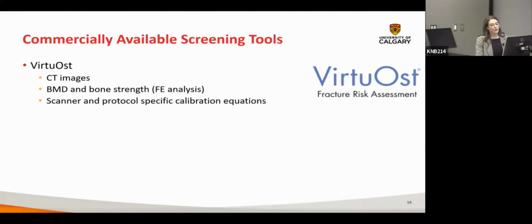So we believe, though, that they are creating calibration equations based on reference data sets for each scanner and each scan protocol. So this is quite time consuming, and the equations will require continual upkeep to maintain accuracy with new scanners and/or protocols that are being combined. And that is out of the US and it is FDA approved.